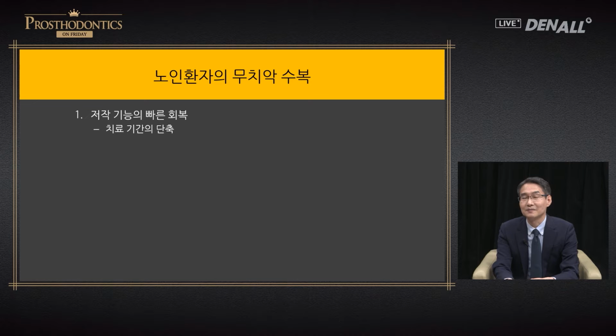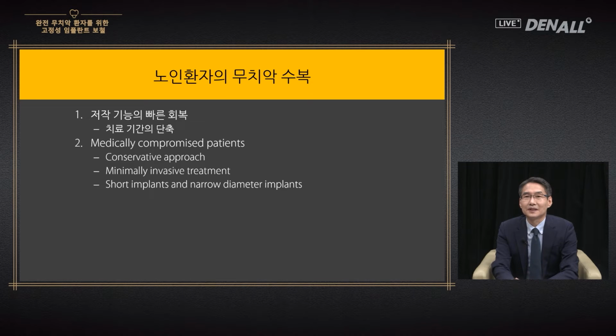One of the methods we can use handily is immediate loading. There are not that many dentists who utilize immediate loading a lot. If you put in the effort and utilize it, this is a very strong tool.